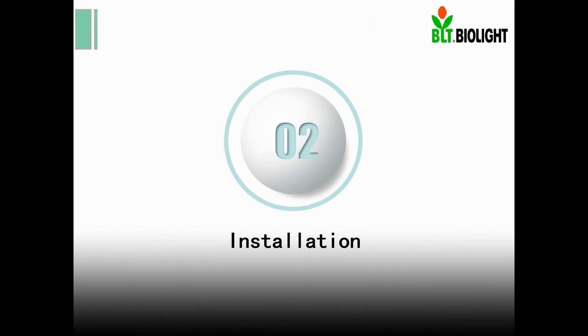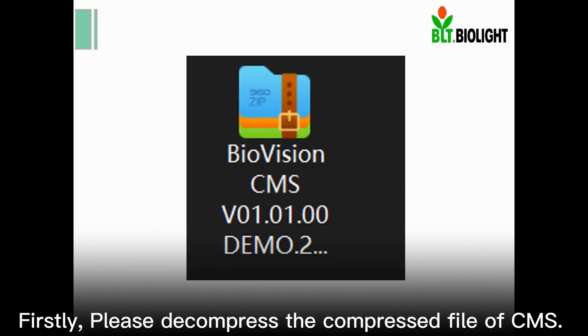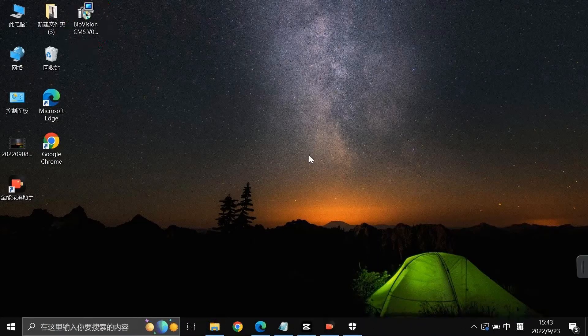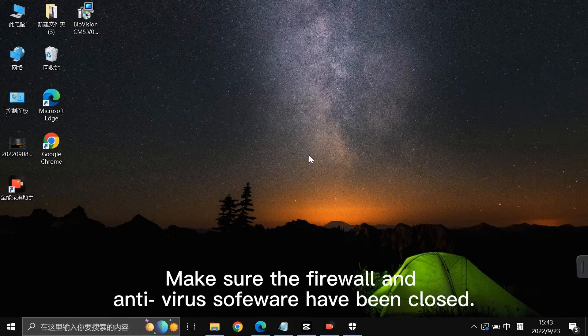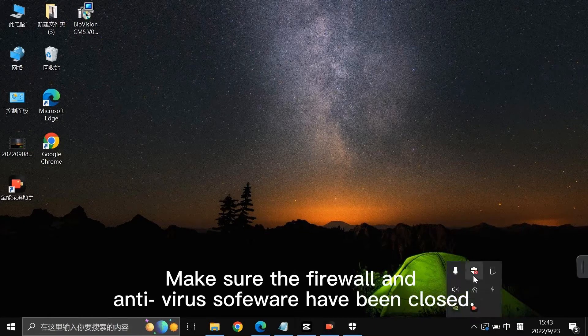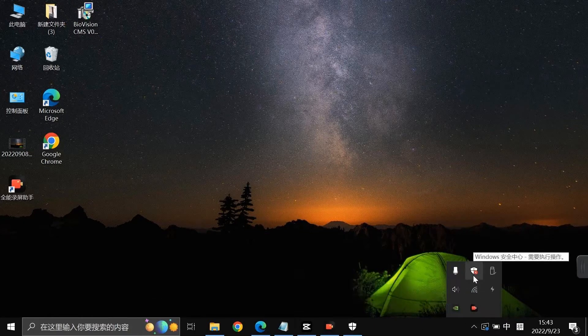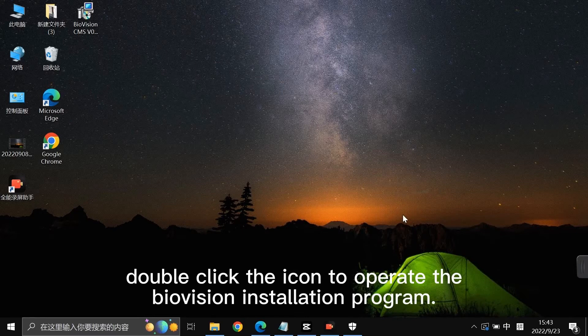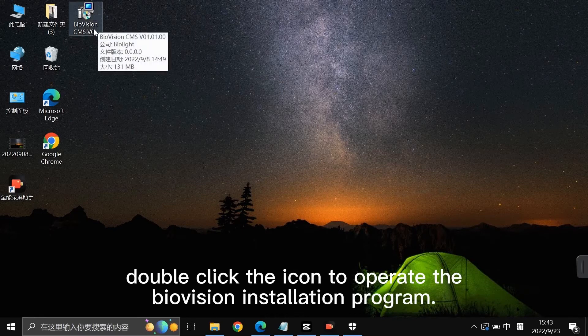Installation. Firstly, please decompress the compressed file of CMS. Then you will get an installation program of BioVision. Make sure the firewall and antivirus software have been closed. Double-click the icon to operate the BioVision installation program.